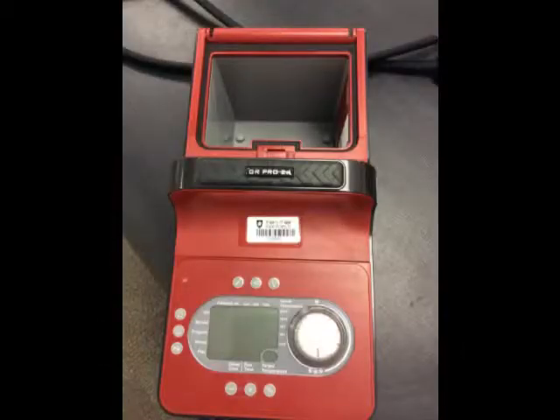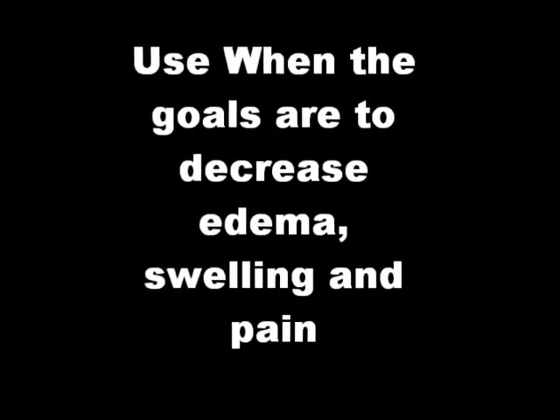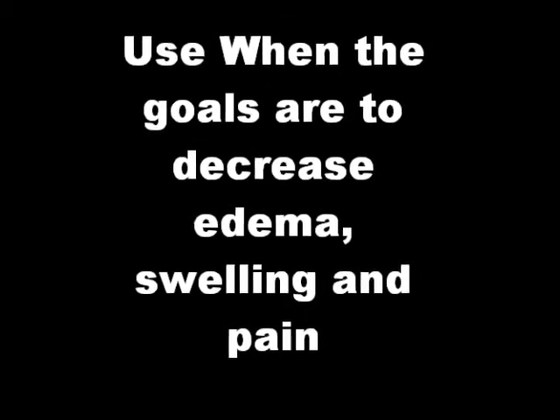injured area. Some advantages of the GameReady is it doesn't get as cold as an ice bag, so it can be used with people who are sensitive to the cold, and it also requires little clinician time. The indications to use the GameReady are post-surgical acute injuries to reduce edema, swelling, and pain.